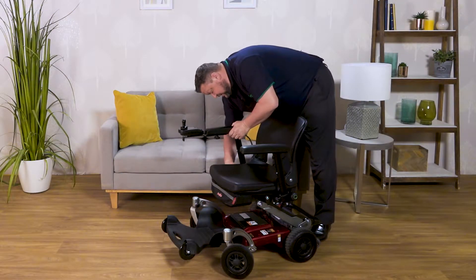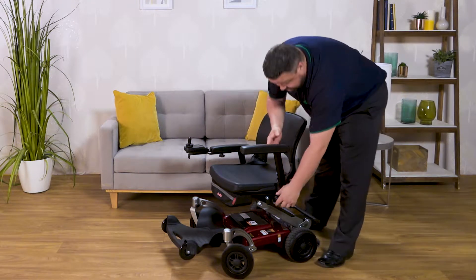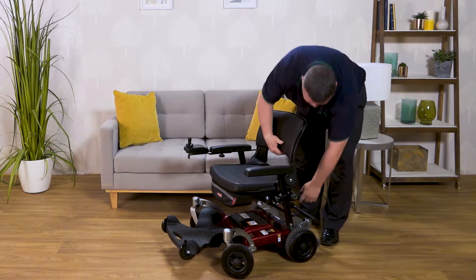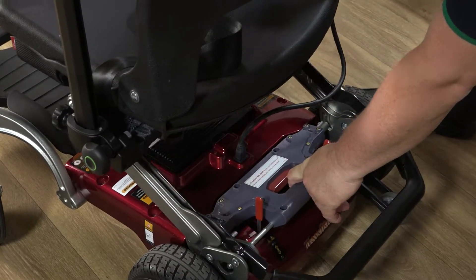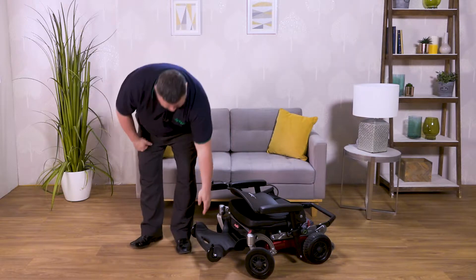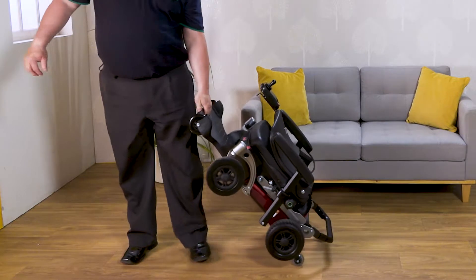The travel chair actually allows you to travel with it. Just dropping the armrests down, drop the seat down to its lowest, and then we have some travel wheels at the back. Lift them up at the front and there we go.